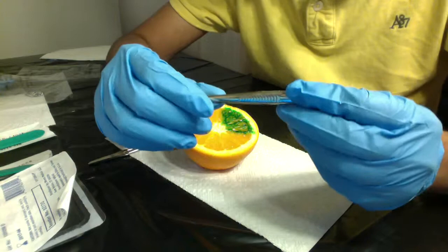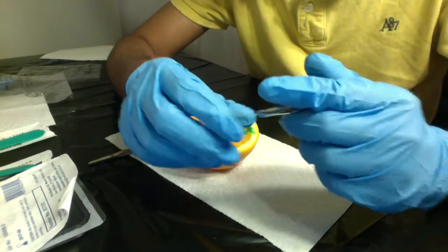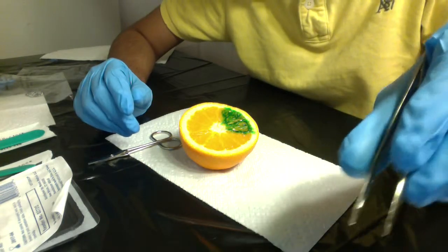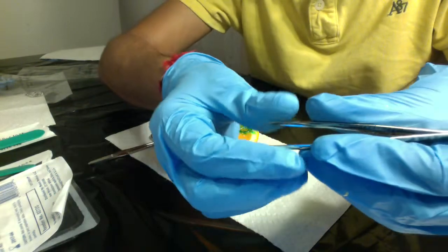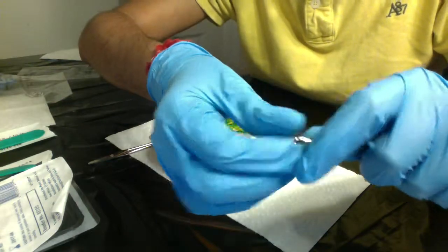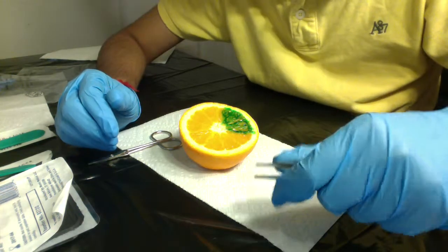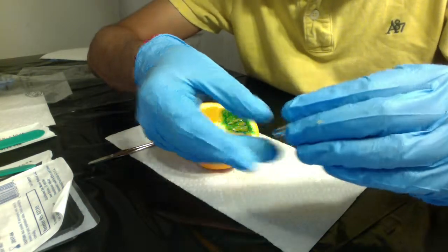Now, first, grip of the forceps. 2 different techniques. One is holding the forceps in the web space and using fingers and thumb on the opposite direction. And the other technique is to grip in the palmar surface and just use the finger and the thumb this way. Out of these two, I find this method a little easier, probably because I have longer fingers maybe.